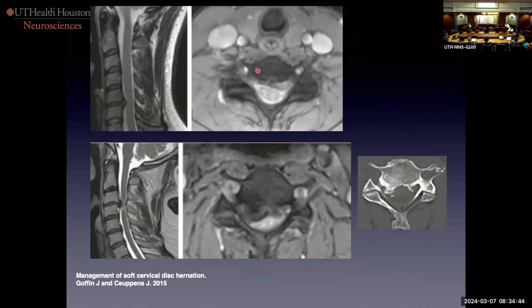How can I tell these were GRE images? Flowing blood is bright — that's a dead giveaway. The internal architecture of the spinal cord is well seen, and tissue contrast in general is poor. The margin of bone is not well seen because it also has magnetic susceptibility and is blooming — getting bigger and blacker.